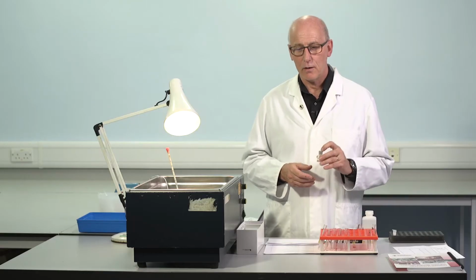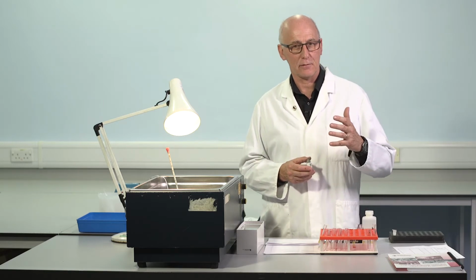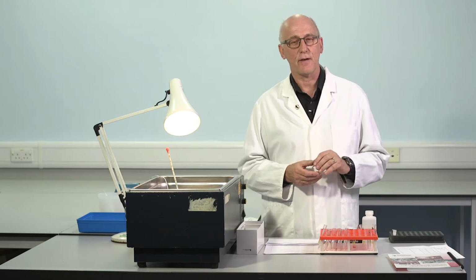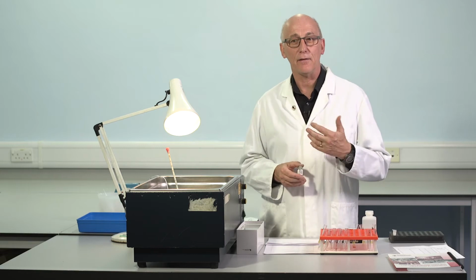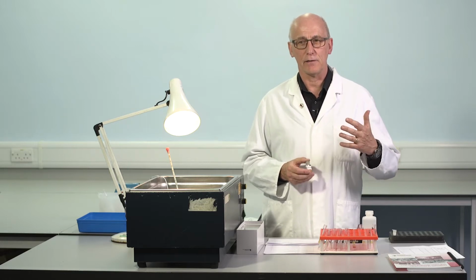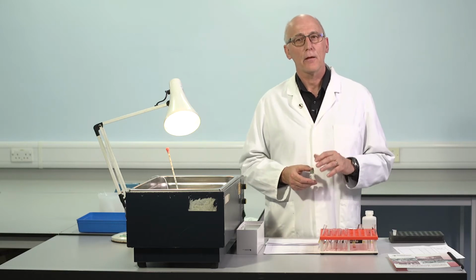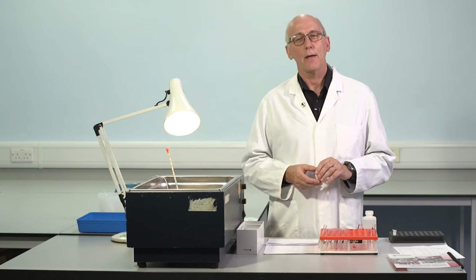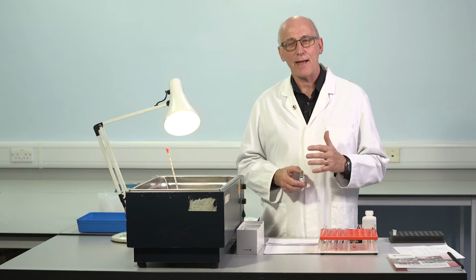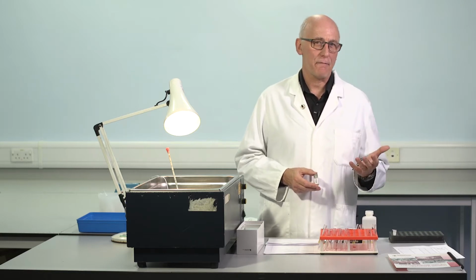So we're going to use this to construct different concentrations of factor VIII. And we do that by dilution. The more we dilute, the lower is the concentration. We need to have a linear relationship between the APTT, which we perform on the deficient plasma, after we've added different concentrations of factor VIII. We need a linear relationship between the amount of factor VIII we're adding and the effect on APTT. And this is typically possible if we start with a calibration plasma in which the factor VIII is usually close to 100 international units per deciliter, if you prefer one international unit per mL. Usually it's a little different from this, but it's usually close to this for a pooled normal material. And for that type of standard, we frequently use dilutions beginning either at 1 in 5 or 1 in 10 dilution.